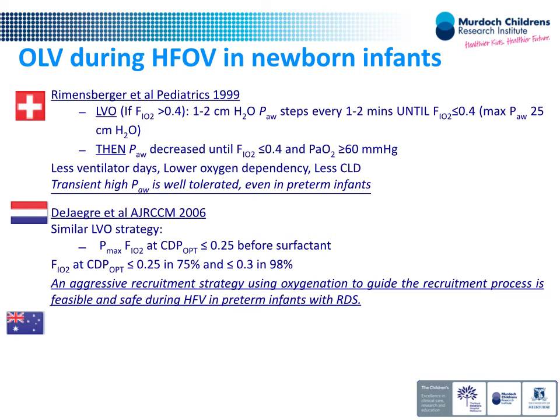But then if you achieve this FiO2, what is the criteria to give surfactant? Well, that's another question which I'm not going to discuss. So again, I'm probably on Anton's point of view, and you do give surfactant. And I think the logic, do you want to explain the logic rather than me explaining your logic? Because I agree with it.